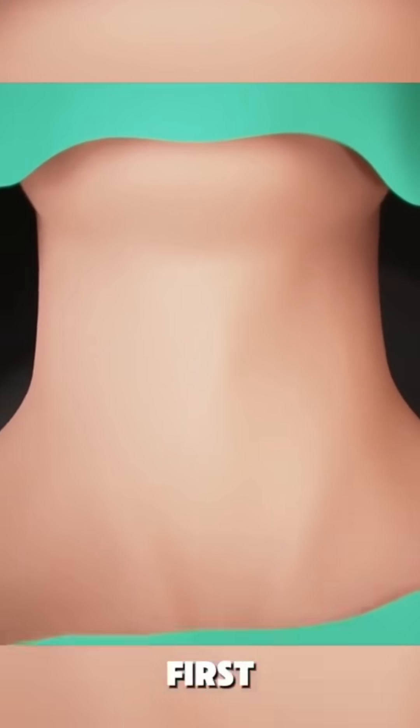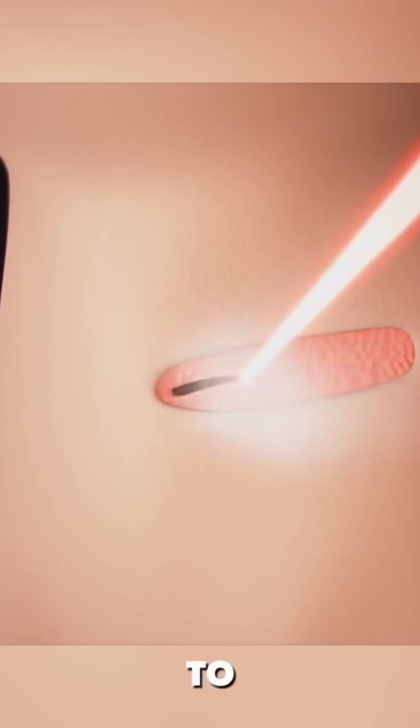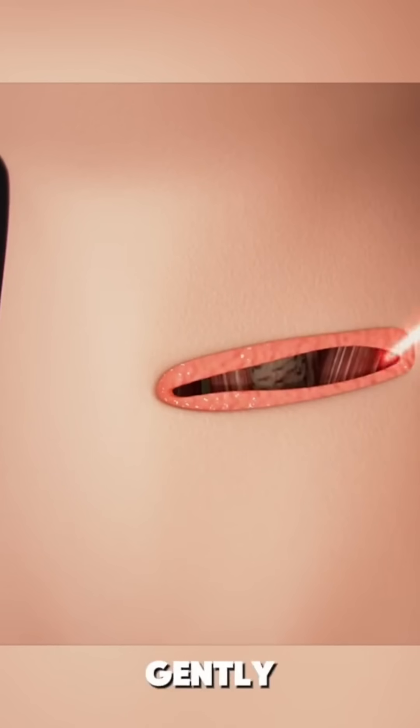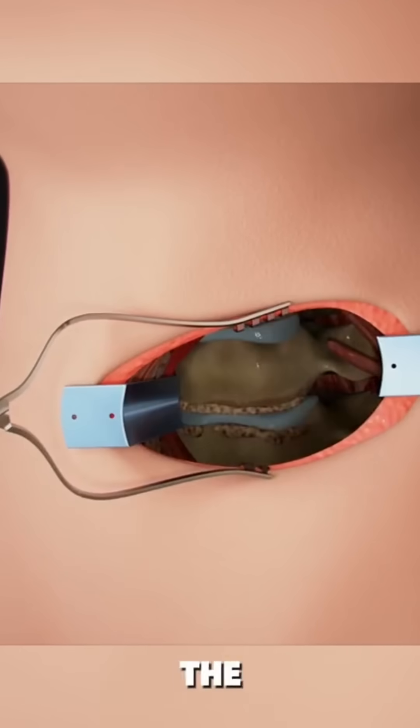First, under anesthesia, a small incision is made at the front of your neck to access the cervical spine. The surgeon then gently moves muscles, tissues, and other structures aside to reach the problematic disc.